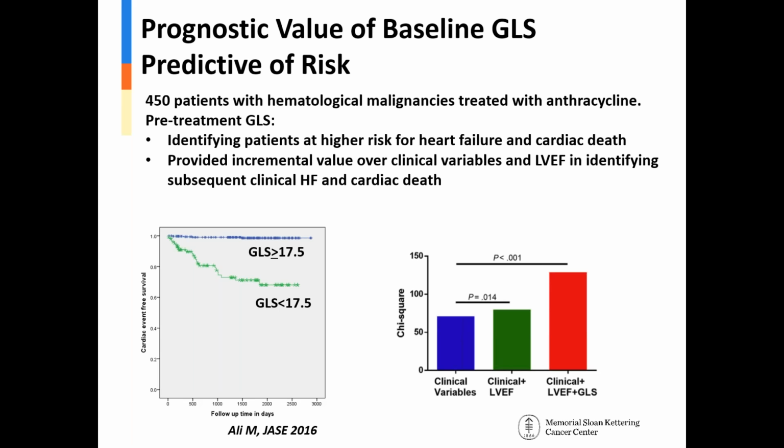To that point, I would also say we have these automated algorithms now, and I think the temptation is to say, oh, it's automatically tracking, so it's fine. We can just see the number and report it out. And again, it comes back to really reinforcing the quality of the data, looking at the quality of the data before you report it out, because the automation is great, but it's not perfect.